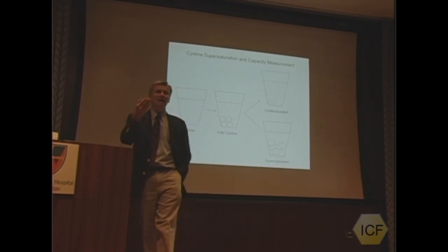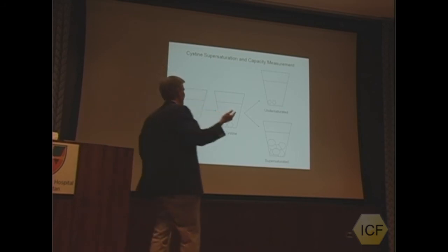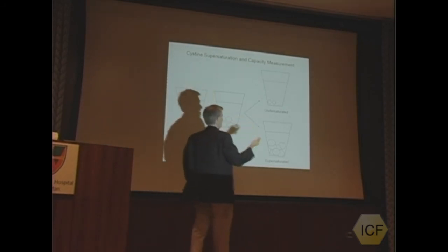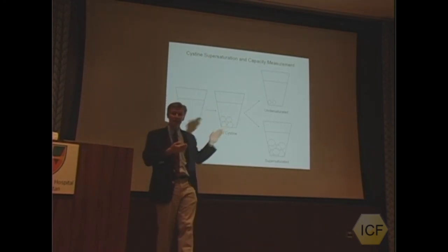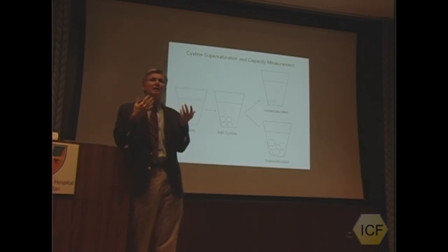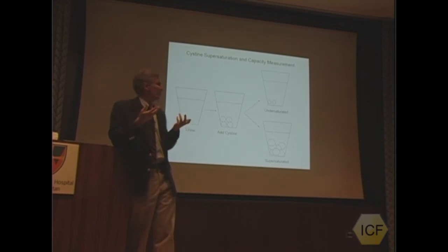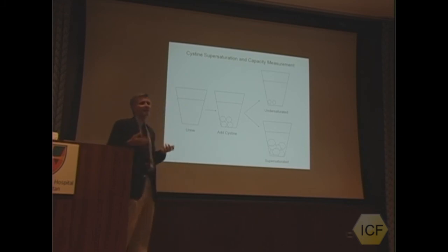This takes into account the activity of the drug. It will now tell us if the drug is actually functional and working in preventing or changing the solubility characteristics of the cystine. We'll see it reflected in the cystine supersaturation or the cystine capacity. You want a urine that is undersaturated. You want a urine that has a positive cystine capacity, that is not going to crystallize, but in fact could actually tolerate having crystals added to it, and those crystals would actually dissolve.